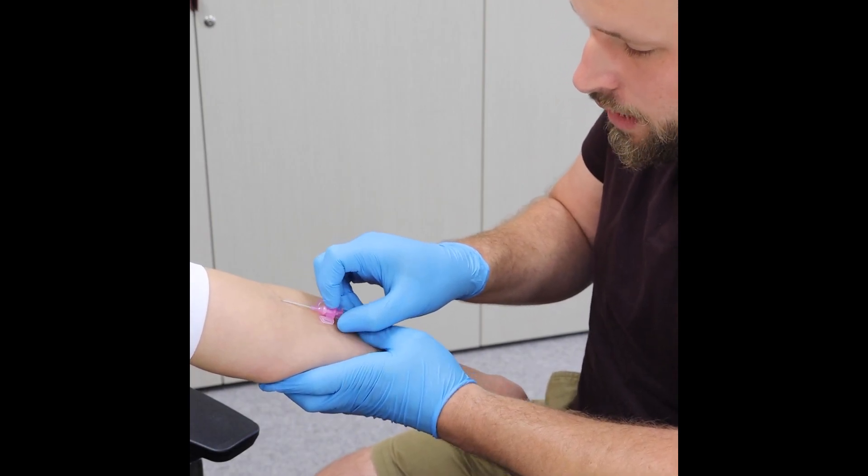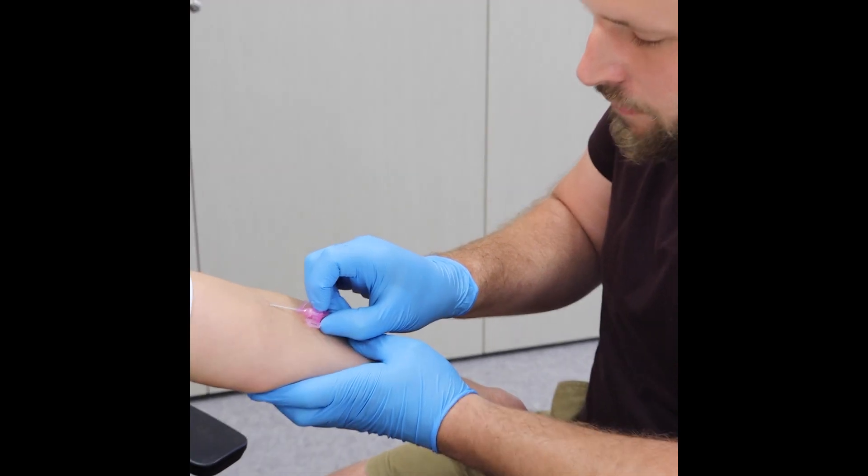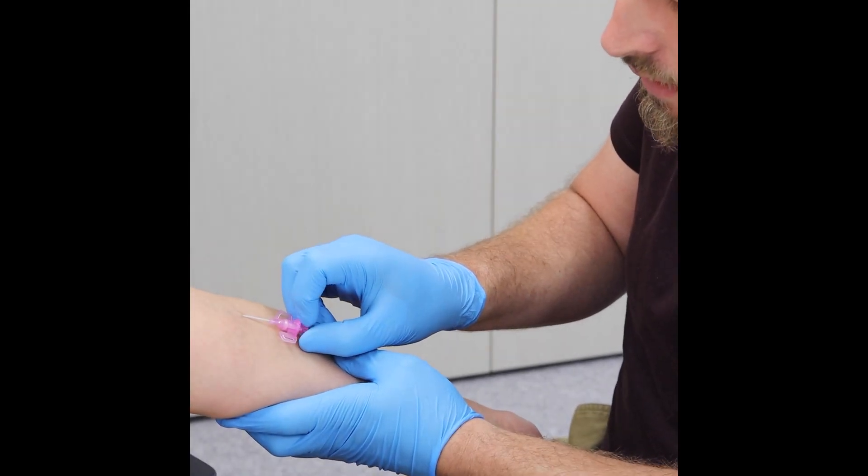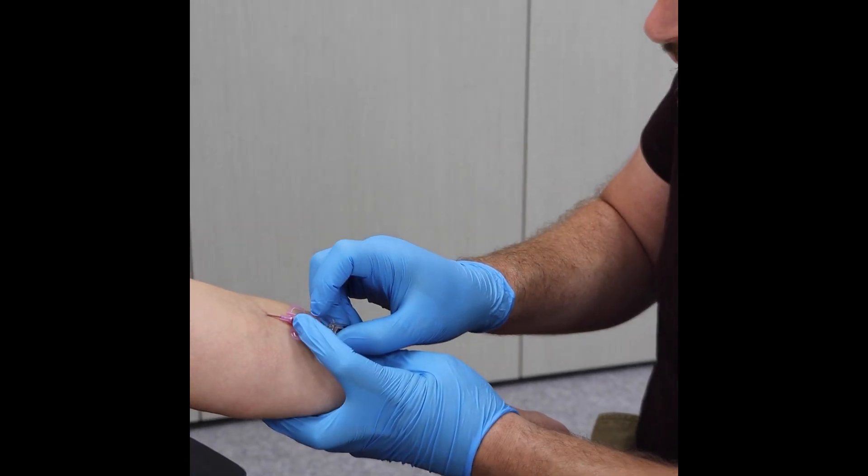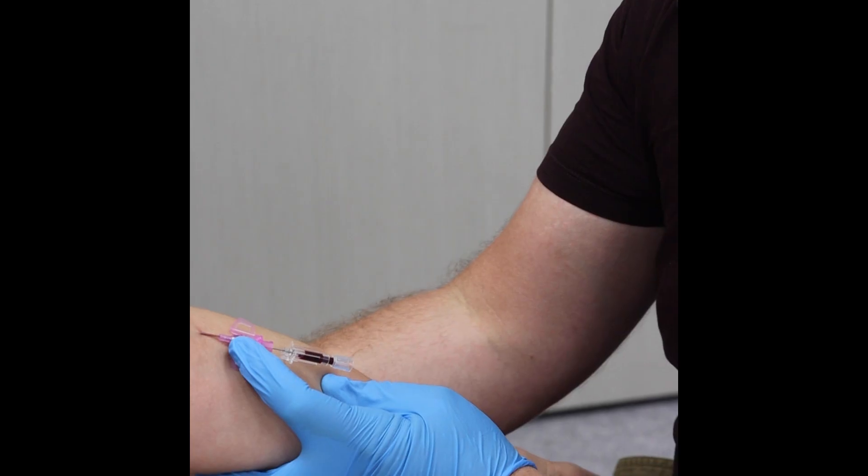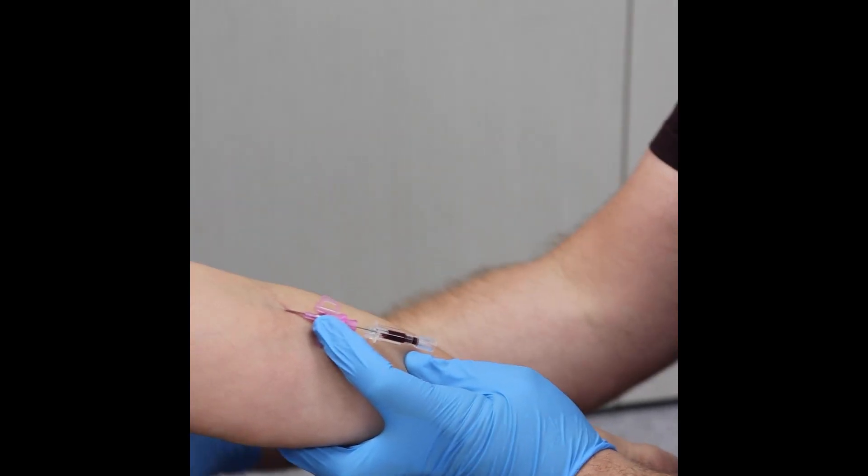I've got my flashback, lowering down, advancing my catheter. I start advancing and I can't go any further. I'm wondering why I can't go any further. So I'm not 100% sure what's going on.